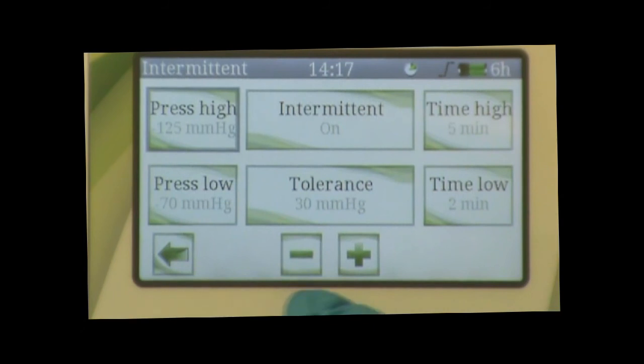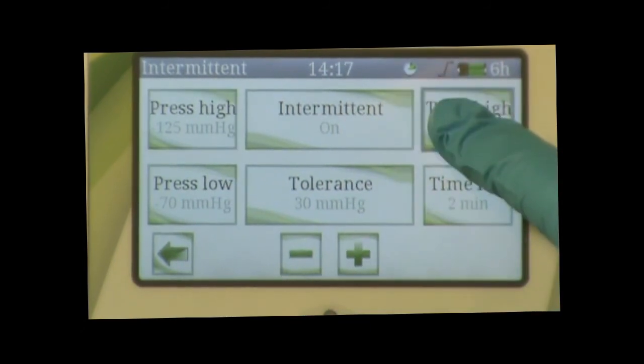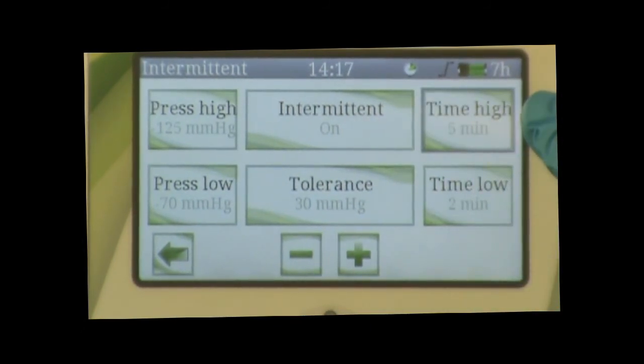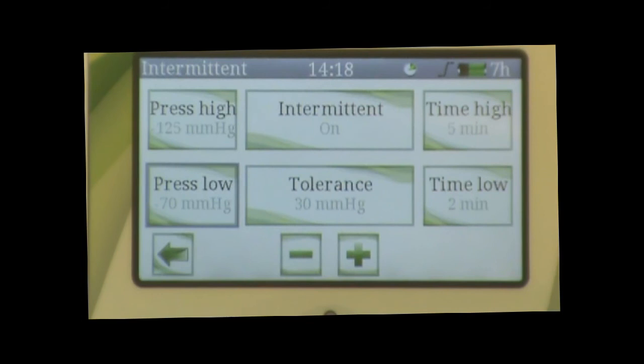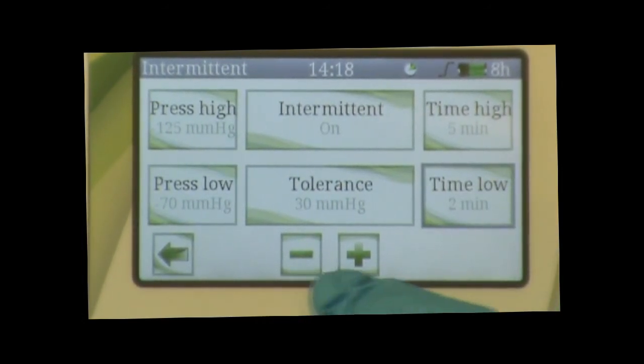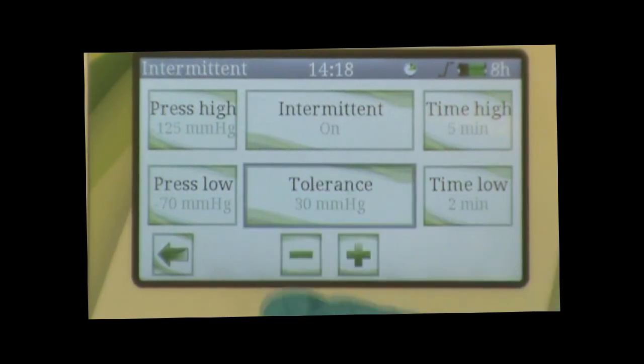Set your high pressure setting, set your high pressure time setting. This is scheduled for five minutes. Set your low pressure setting and your low pressure time setting. You can also adjust your tolerance.